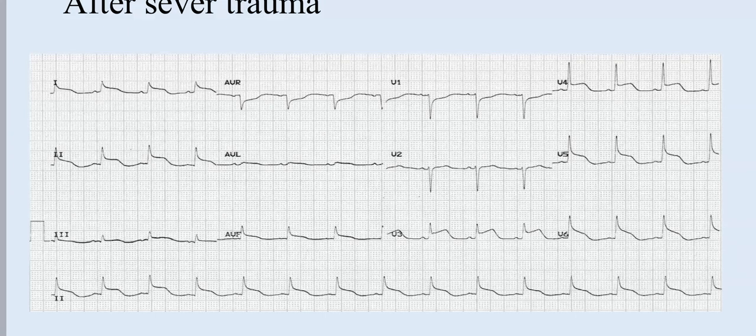We have so many patients with massive intracranial insults showing gross changes in the ECG, gross changes in the cardiac biomarker, gross changes in the echo. You don't know what to do about them. That is all reactionary to the intracranial injury. So intracranial injury can lead to ST segment elevation, a massive one, and can lead to giant T-wave inversion. That's more usual than this ECG. Okay.